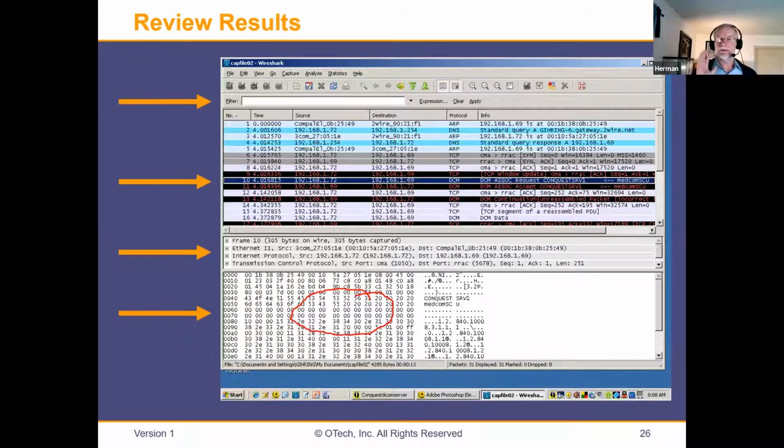Believe it or not, we had a problem one time where images would not be routed to Mr. Smith. It took us a day to figure out that it was actually Smith-space. Smith is not equal to Smith-space. So the images were never routed after hours to Mr. Smith-space. The way we figured it out is we looked at the data right here, and I know by heart that the ASCII code for space is ASCII 20. I know that by heart because in many cases I have to troubleshoot it. That's probably the only reason you might ever want to look at the raw data.